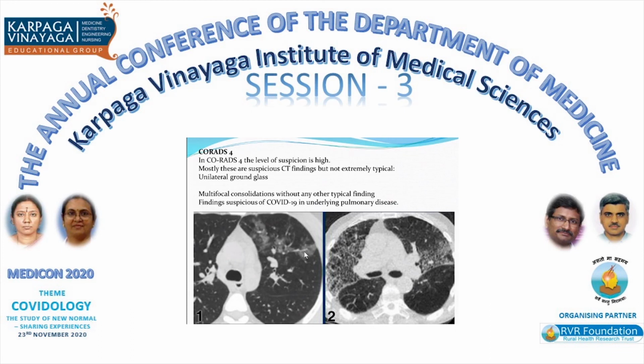Another case where there is interstitial lung disease, but there are some ground glass changes here. So whether it is a COVID superadded on ILD, we are not sure. So in such cases, we have to be careful. So CORADS 3 and CORADS 4 are quite indeterminate, and we have to be very careful.